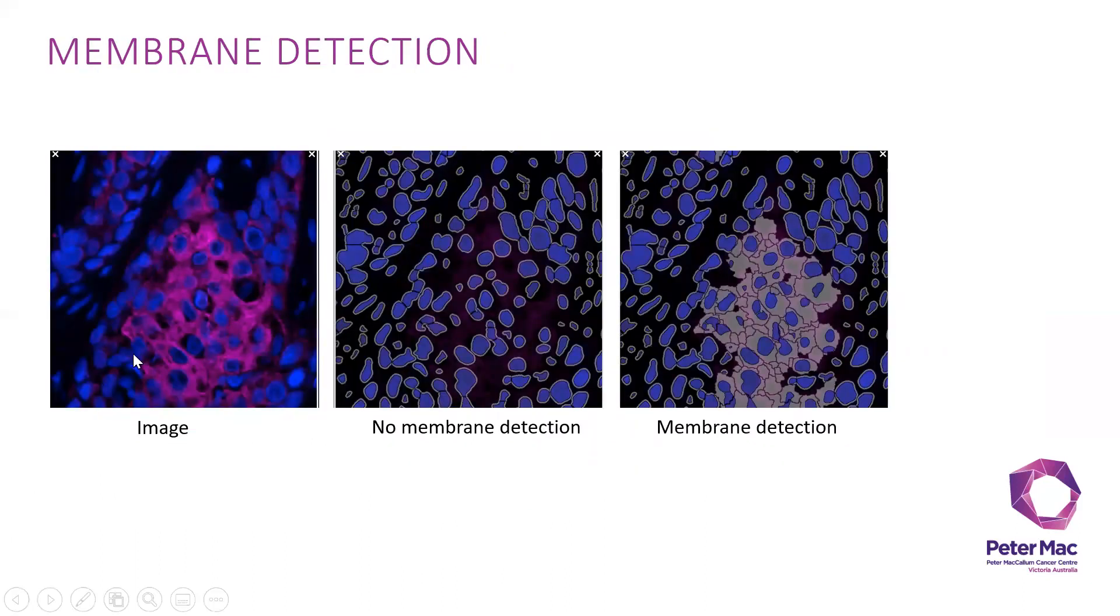For example, membrane detection: you can see the raw image here on the left is AE1/AE3 staining. If you don't use membrane detection, it will just be the nuclei and the halo around it for the cytoplasm. The membrane detection helps you to annotate and segment the whole membrane around the cells. This will help to have more accurate cell segmentation.